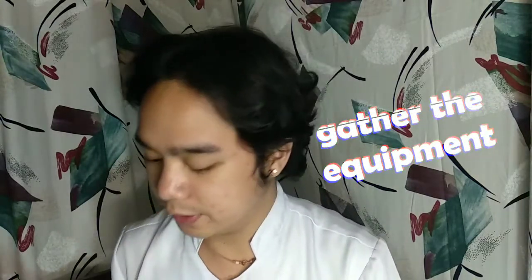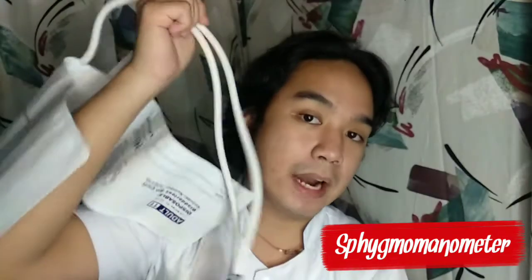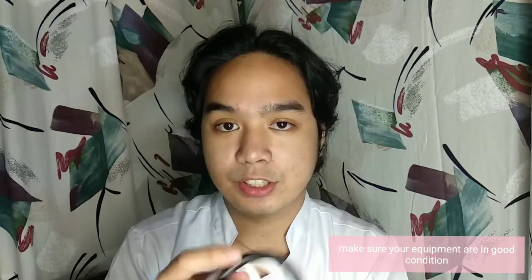Once you're done gathering the equipment, your sphygmomanometer, your BP cuff, your BP apparatus, and your stethoscope, make sure your equipment is good and conditions are good. Okay, so now let's wash our hands, then go to the patient.